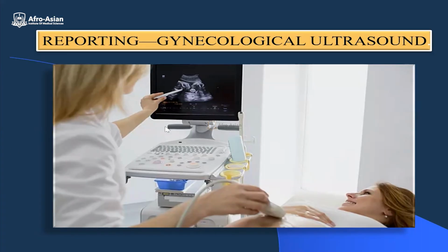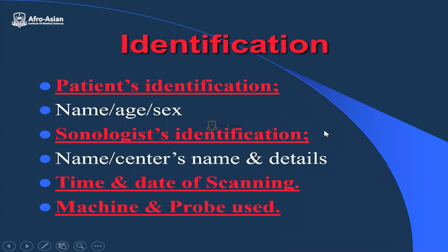Today we will be discussing report writing in gynecological ultrasound and obstetrical ultrasound. First is the report writing in gynae. The first part of your report is the same as that of abdomen, that is, identification.